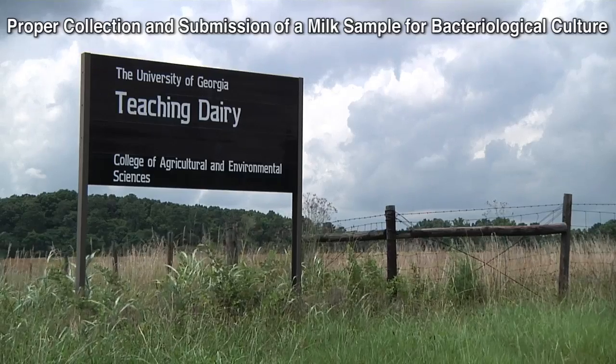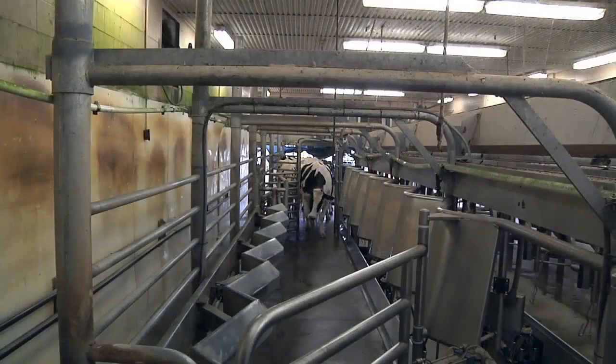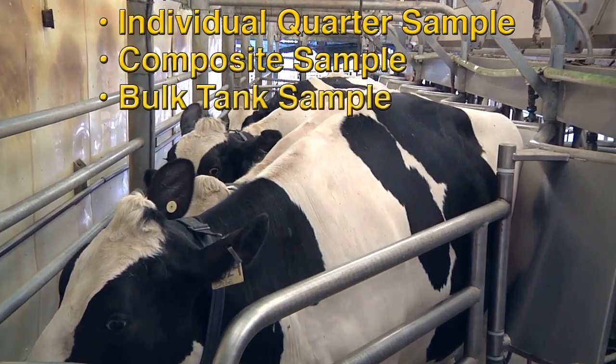This video will provide an overview of three types of milk sample collection for bacterial culture: specifically the individual quarter sample, the composite sample, and the bulk tank sample.